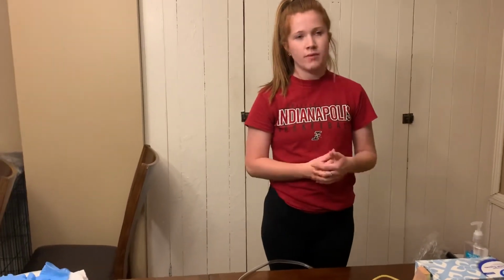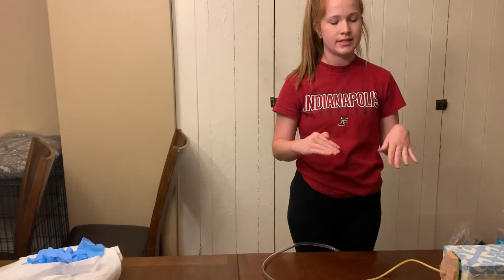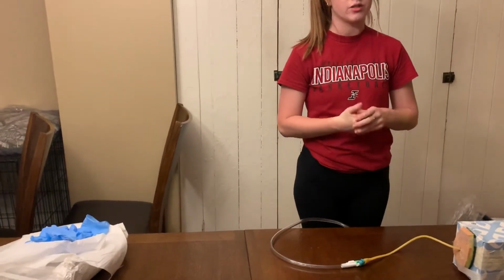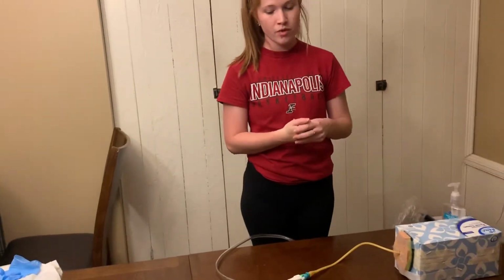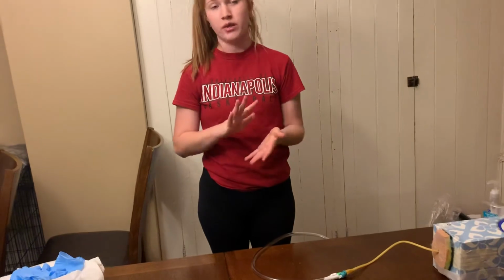I could then document in the system that I placed the catheter, the catheter size, the volume of urine that was collected, and the color and the clarity of that, and how the patient tolerated the procedure. After that is finished, I would be done.